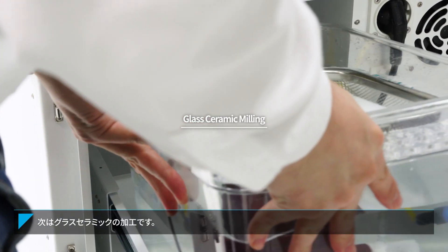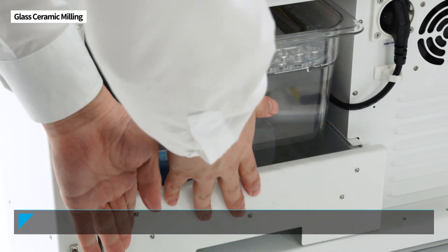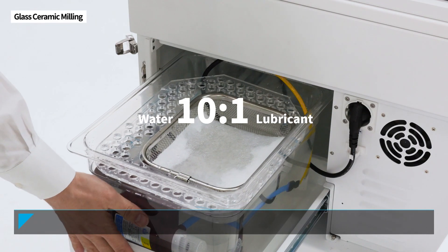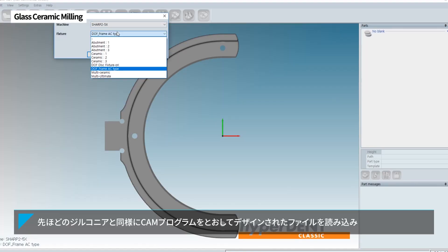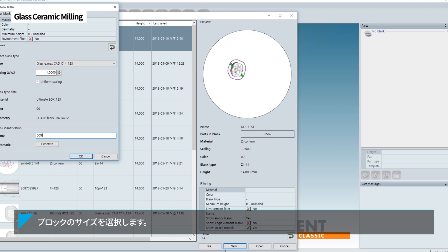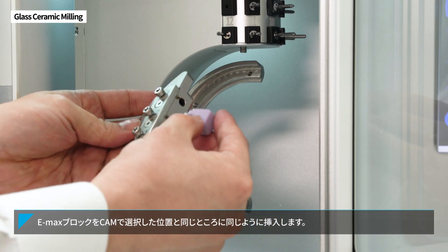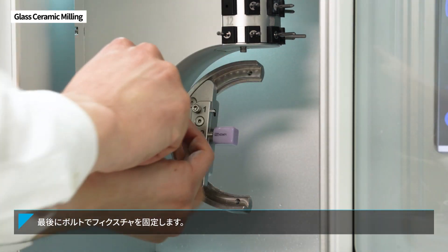Next, let's try glass ceramic milling. Fill the water tank with 7-8 liters beforehand. For stable milling, mix the lubricant with water at a ratio of 10 to 1. Use the CAM program to import the pre-designed file the same as before, and then select the block size. After properly positioning the crown on the block, insert the block in the same slot number output as the CAM. Finally, use bolts to mount it to the fixture tightly.